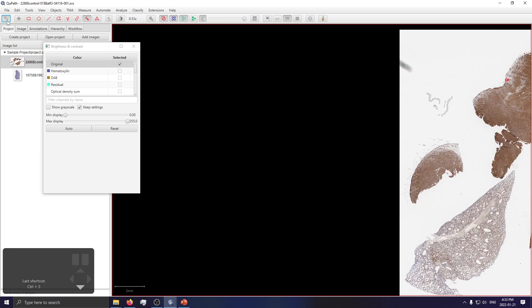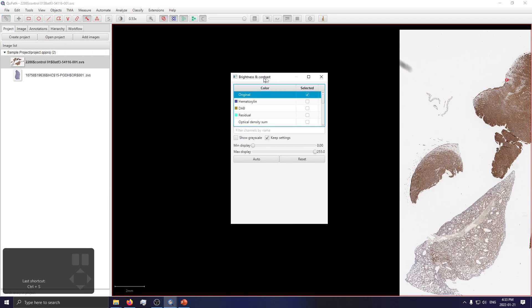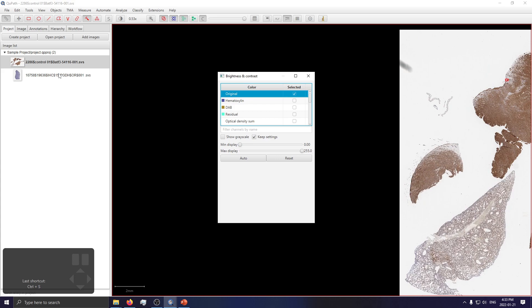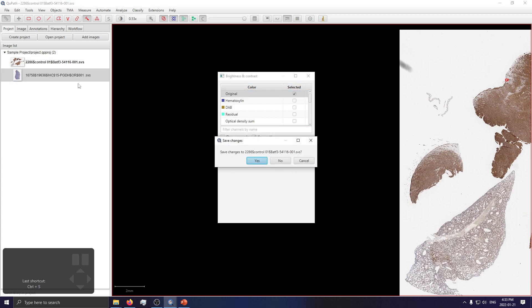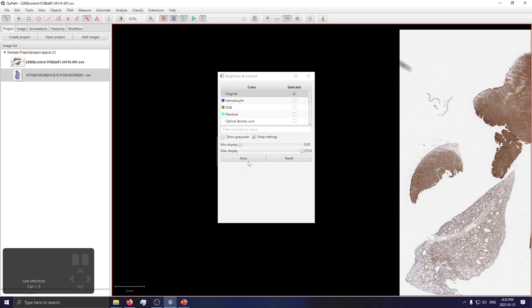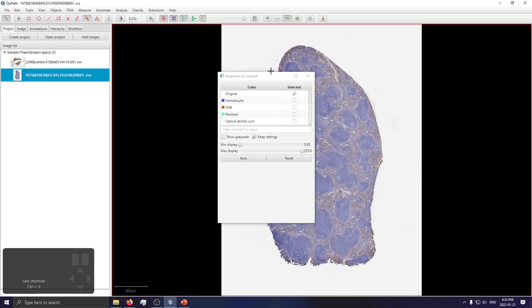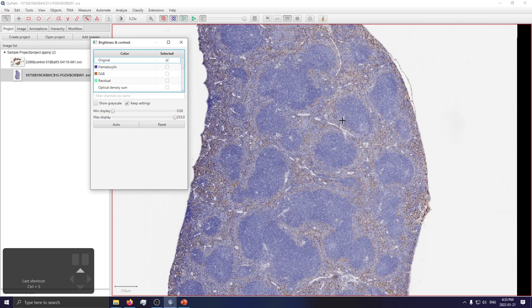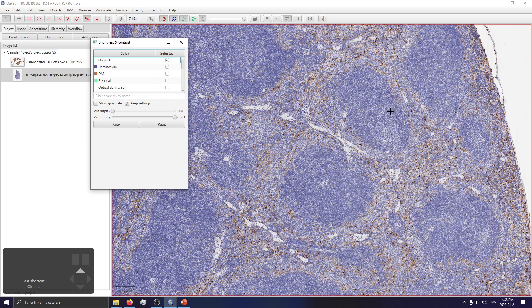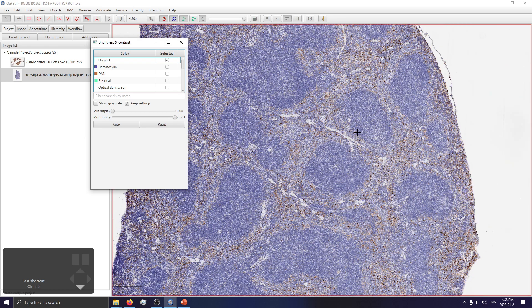One last thing: if you want to go to the next image, just double-click on the tab, click Save Changes if you made any annotations and want to keep them, and you're onto your next image — it's loaded, it's in memory, good to go.